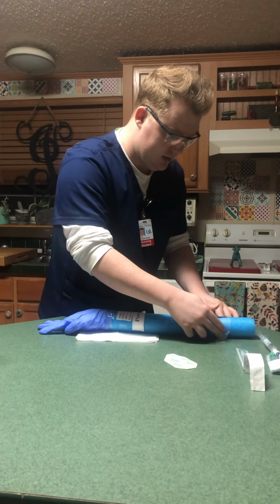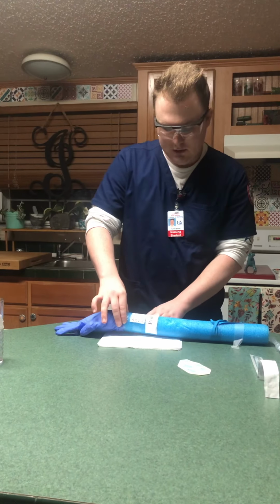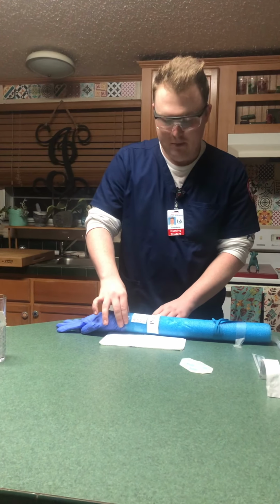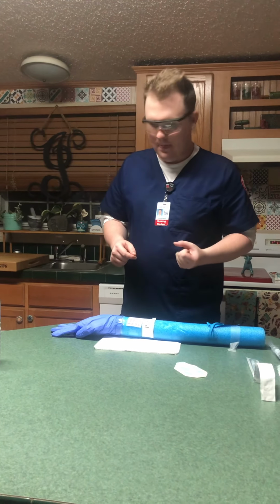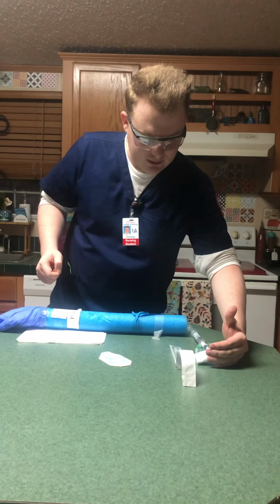I'm making sure it's not too tight. Now I'm checking the radial pulse, and I have the waterproof pad down here as well. So now that I have checked the radial pulse, I am going to move my saline lock.